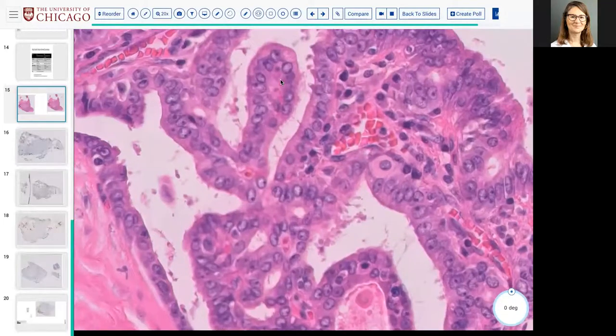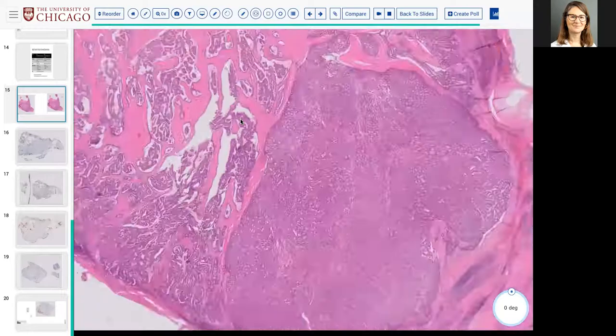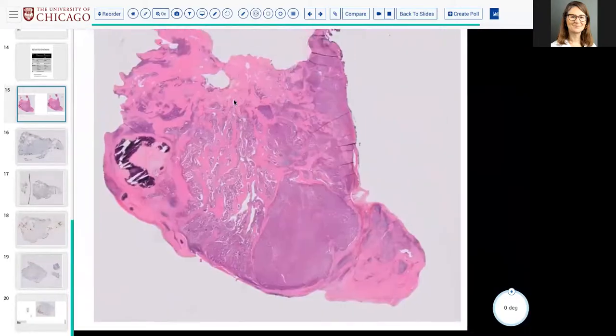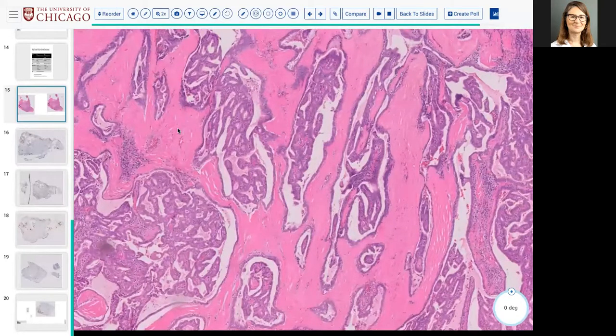But there are papillae and there are follicles, so architecturally it could be PTC, and it was called PTC on FNA. You want to think about the columnar cell variant, which I think morphologically we can probably exclude, but what are the two immunostains that columnar cell generally stains for? CDX2 and ER. You could do those if you wanted.